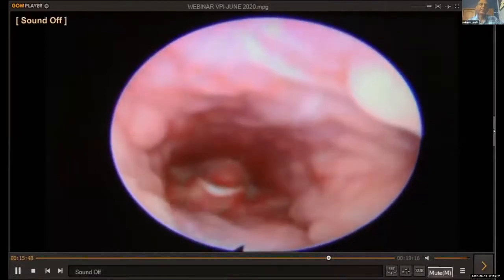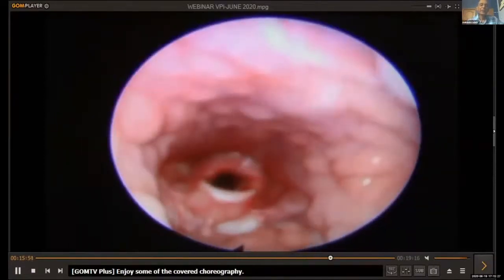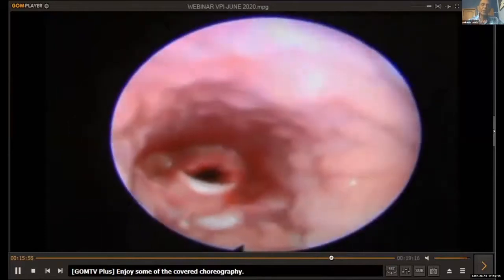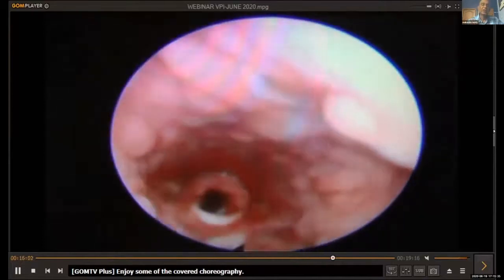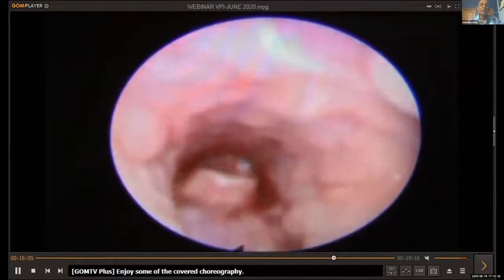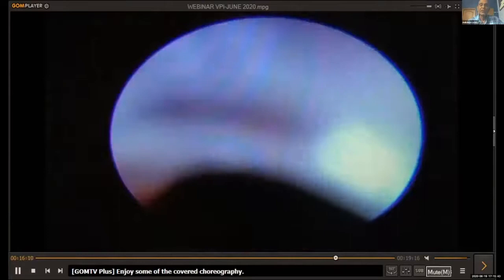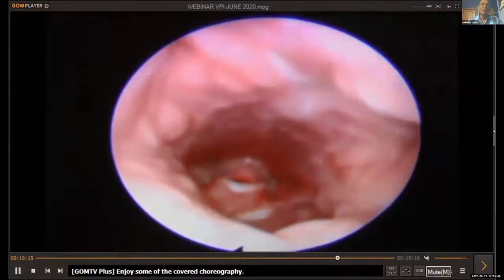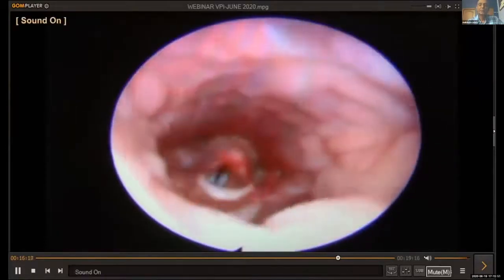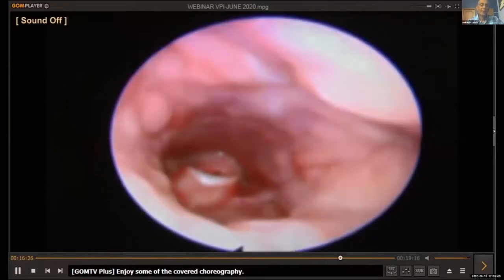You can see the sound being produced in the vocal cord. One of our speech therapy colleagues with me in a workshop specifically said you have to go down and visualize the vocal cords when you do the endoscope, because you can then know if there is an abnormality in the vocal cord like nodules. Here there is an indication of small nodular things, which I am not sure about; an ENT colleague has to comment on this. But then you can visualize how it works in a glottal speech.